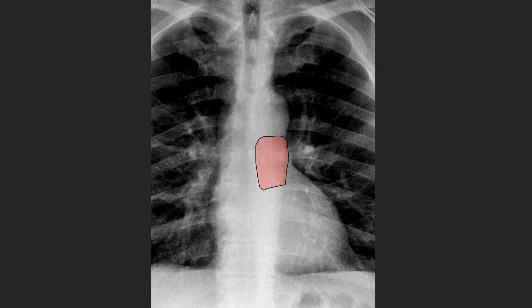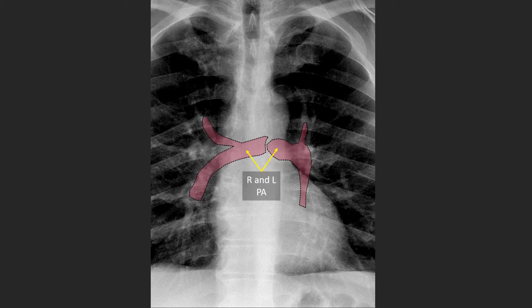Regarding the arteries, the first one is the main pulmonary artery, which comes off the right ventricle. The artery then divides into the right and left pulmonary arteries. The right pulmonary artery has a very horizontal course, whereas the left pulmonary artery goes up and over the left main stem airway.